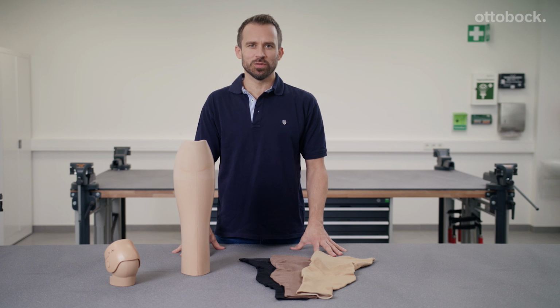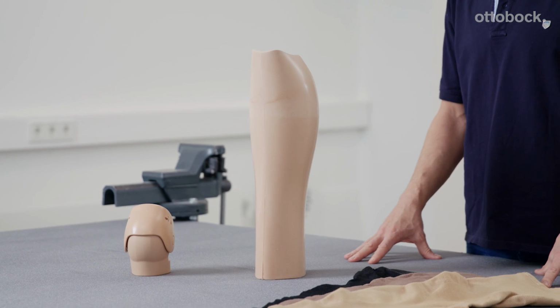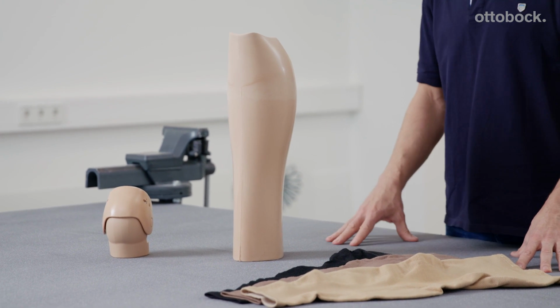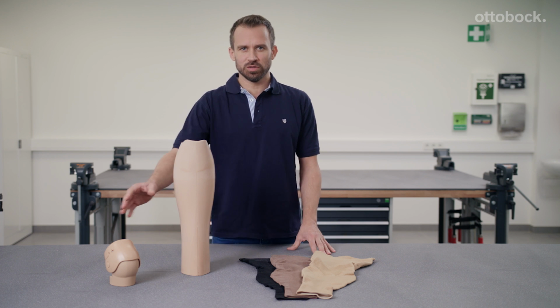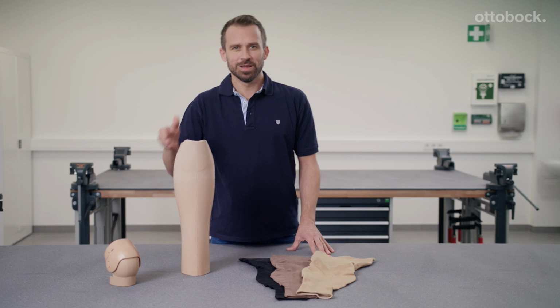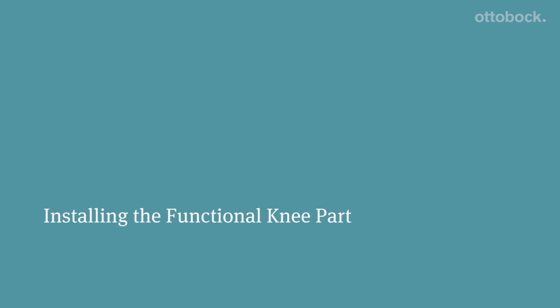If you are fitting the Genium or C-Leg 4, you can use a few additional components to fabricate a functional Cosmesis, which is quite different from a conventional foam solution. Plus, it looks attractive and will impress your customers. To do this, you will need this functional knee part, the shank, and finally this functional stocking.